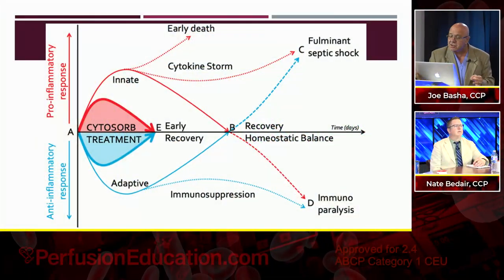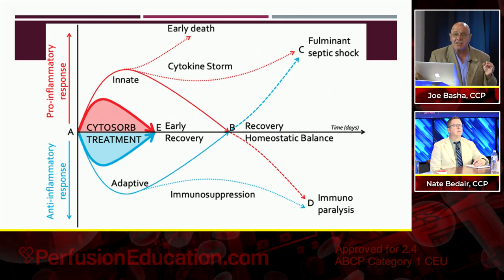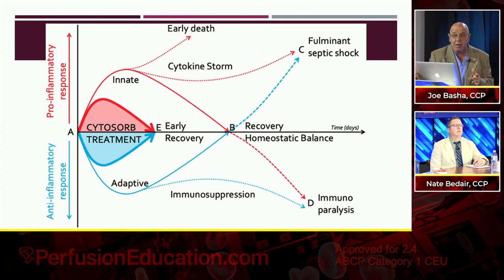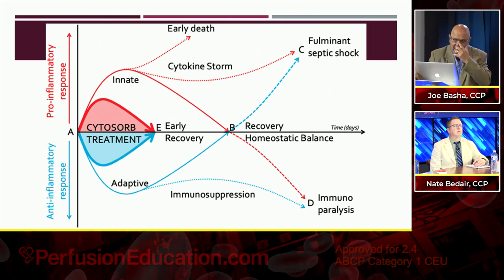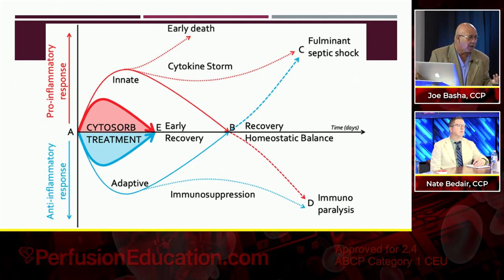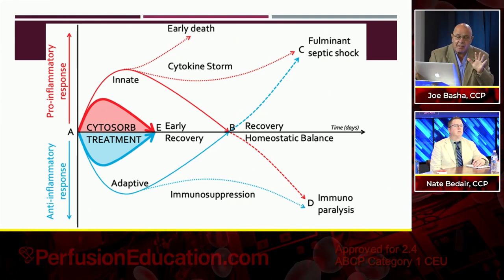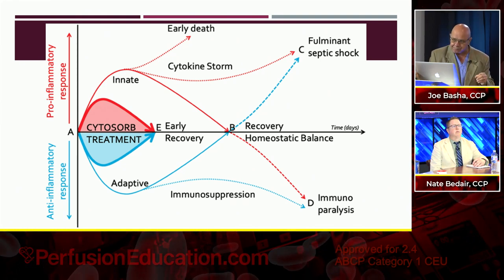So let's talk about CytoSorb. CytoSorb is designed specifically. This is a plasma adsorption treatment. Now, you put whole blood through it. I'll show you how it works. And I don't know what the material is. I'm sure it's proprietary, but I'm assuming it's some kind of a charcoal-based thing. But I'm not sure, so don't quote me on that.